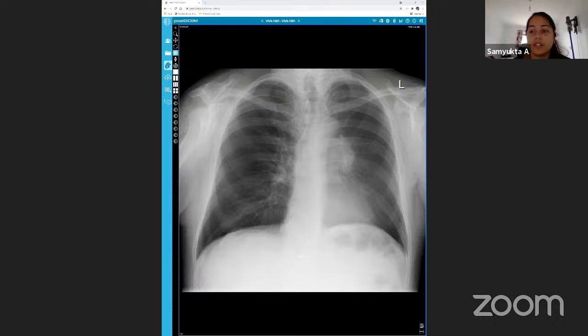So in an adult patient, I would correlate with a smoking history, but the most important etiology that needs to be ruled out is an underlying endobronchial tumor, and the increased density in the hilar region suggests some lymphadenopathy or an endobronchial mass. So they need urgent referral to the respiratory team if they're coming from the GP. They need to arrange an urgent CT thorax and abdomen for staging. I'm also looking at this study to see if there is any bony erosion. There are no pleural effusions, because that would indicate staging from the plain radiograph itself, but they do need to be worked up and discussed in MDT and probably bronchoscopy for tissue diagnosis.